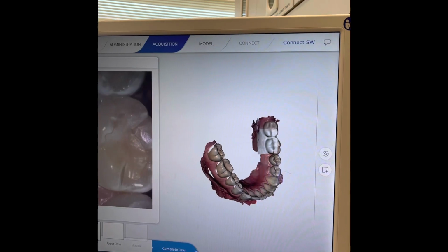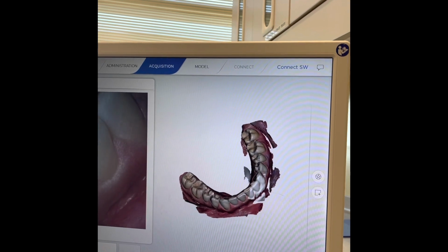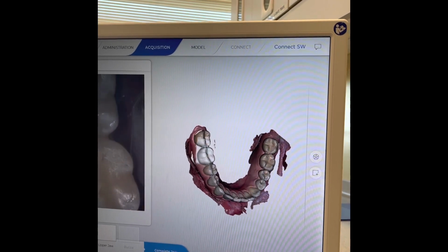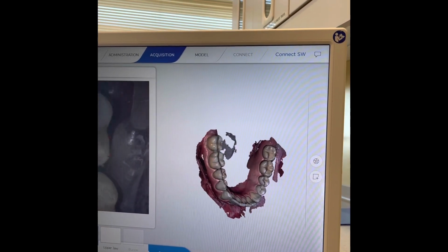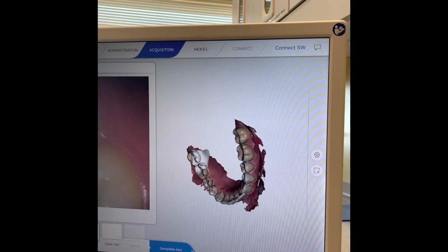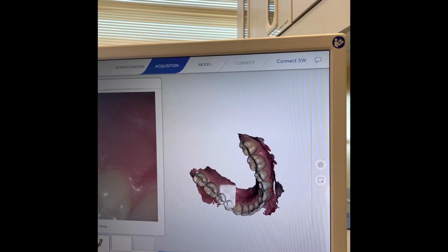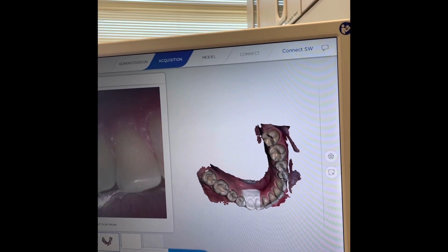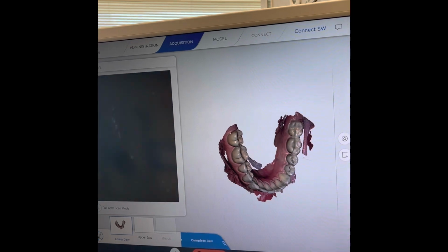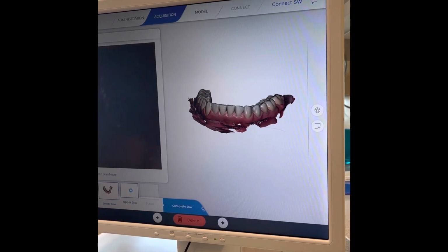And you'll see how quickly it'll stitch information that may be missing. Close down just a little bit more, Dr. David. There we go. Excellent. All right. Perfect. There we go. I'm just doing one more sweep just to make sure we got everything we want. All right. Perfect. Now, if you go back through, you can see very minimal to no missing data whatsoever. So very accurate scan. Now we're going to go ahead and move to the upper jaw.